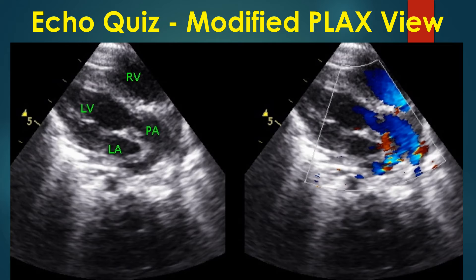In this case, the pulmonary artery is arising from the left ventricle, i.e. ventriculo-arterial discordance. The aorta was seen arising from the right ventricle in another view in this cyanotic infant. There was a small patent ductus arteriosus and a small atrial septal defect. There was mitral-pulmonary continuity without any fibrous tissue intervening. No significant sub-pulmonic gradient was noted. The right panel shows non-turbulent flow in the main pulmonary artery in blue color.